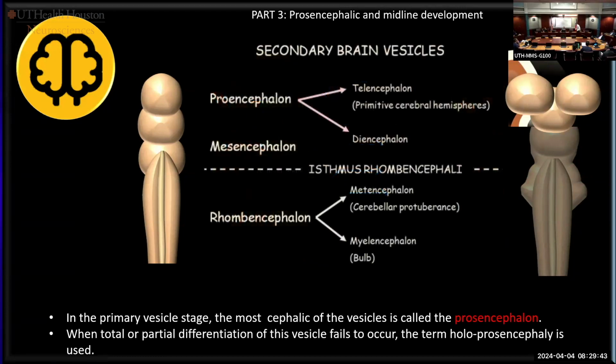So the white matter is going to be crossed in the telencephalon by the gray matter. But the gray matter of the diencephalon is typically going to be gray matter that is less dense. The decreased density of that gray matter is going to make the thalamus look a little bit clearer when you cut it or when you scan it.